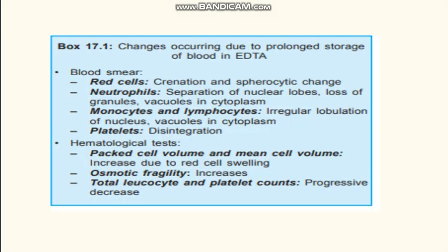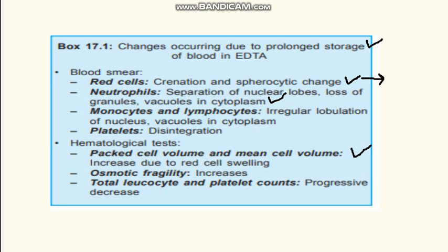Now let's discuss changes which occur after prolonged storage of blood in EDTA. If we store blood for a prolonged duration in EDTA, it will cause spherocytic changes in red blood cells. So if you find spherocytosis in blood films, check whether the blood was stored for a long duration in EDTA. Also there can be separation of nuclear lobes and vacuolation in the cytoplasm of WBCs. In PCV, it can cause increased PCV.